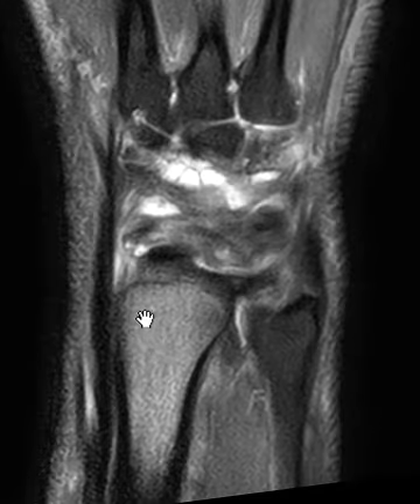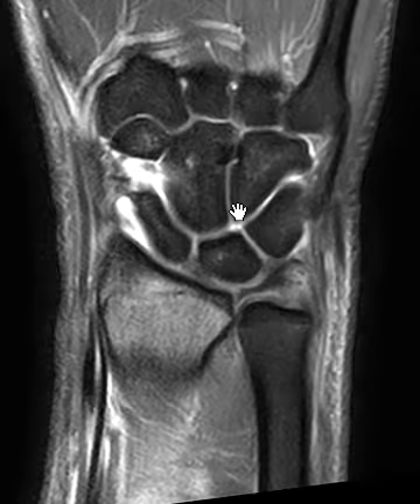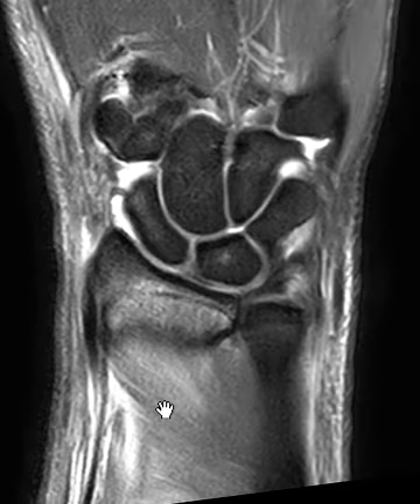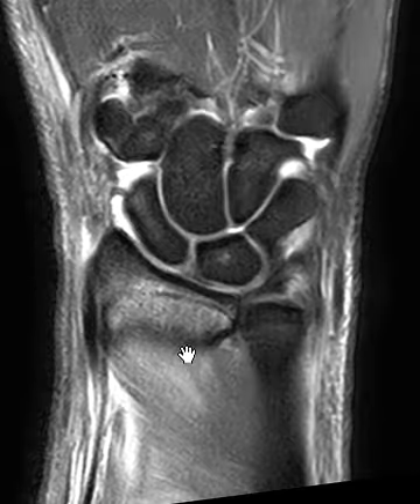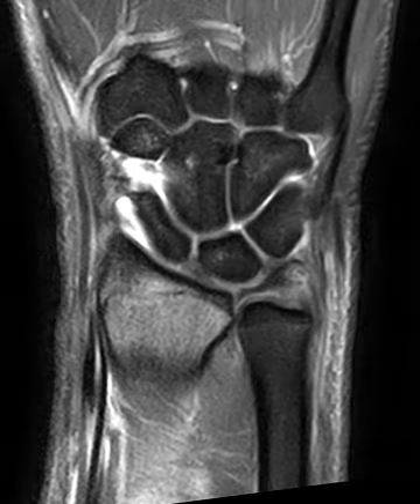In the wrist we do see there's marrow edema in the radius here. This is the ulna looking nice and low in signal, nice low signal in all the other bones, so there's no carpal fracture. The metacarpal bases look good — just the radius has marrow edema, which we'd expect. There's a strain here of the pronator quadratus muscle, and a little bit of fluid in the joint, but there's one other finding.